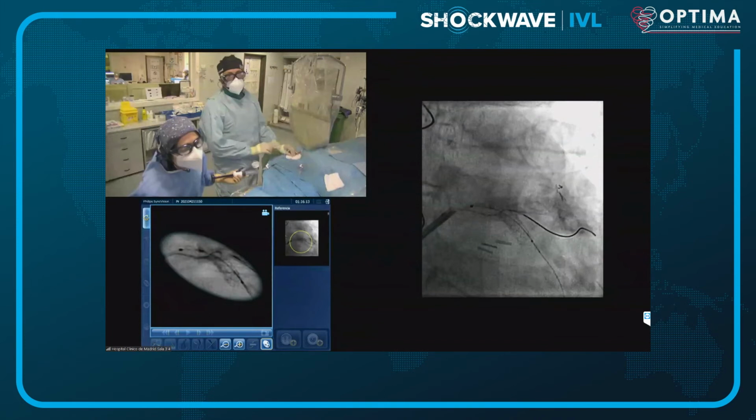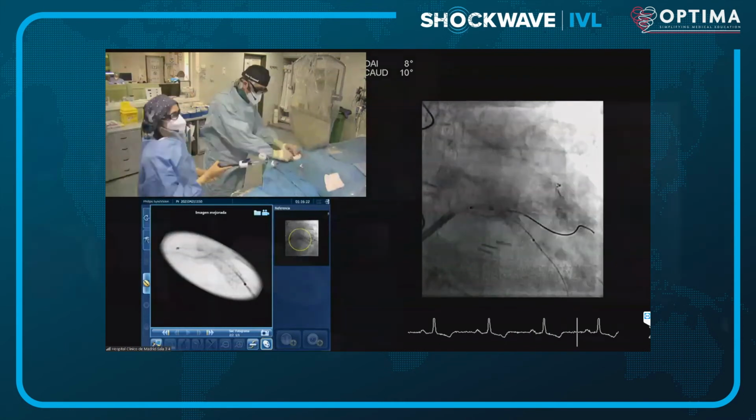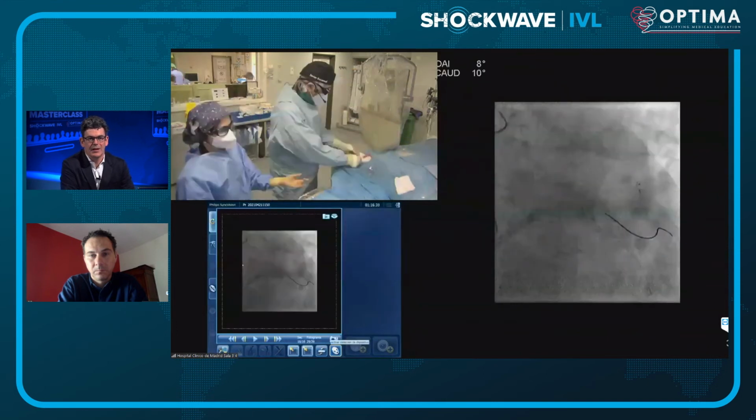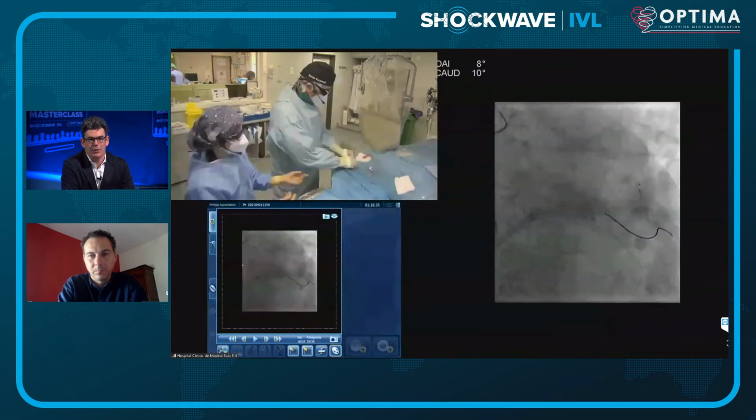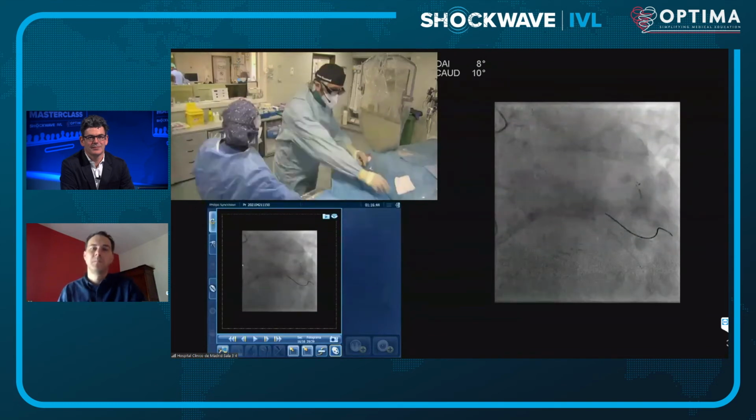There's some interference with the wires, but it looks okay to me, I think. Let's have a look at what happened with that small side branch in a second. We could certainly see good expansion there. There was some indentation, but certainly a vast improvement from the point we started. Very mild, this indentation. I think let's do a POT now with 5.0.